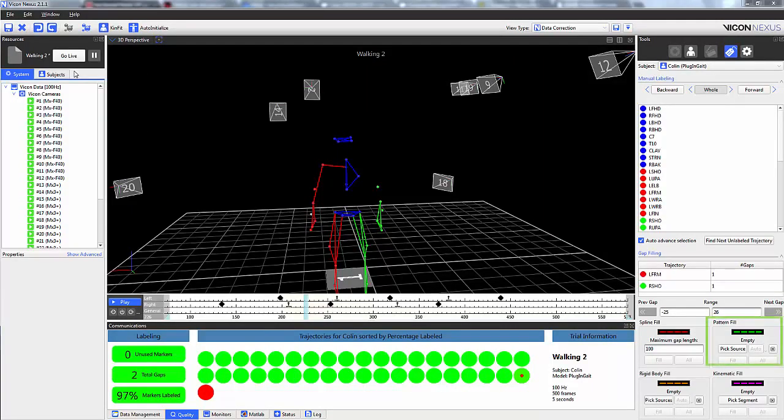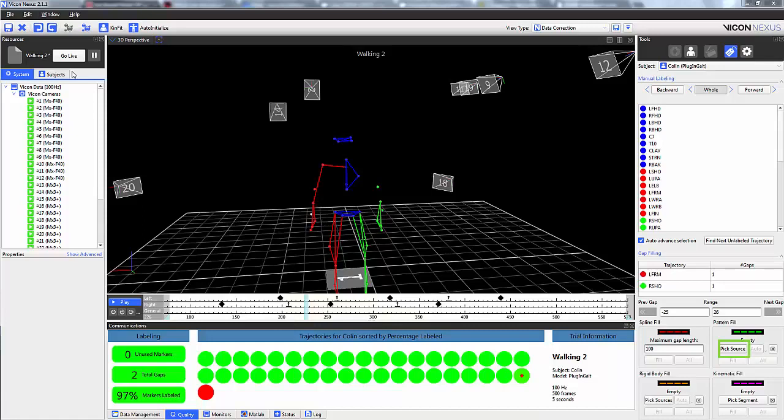We can also use the pattern fill, which is the green line. The pattern fill uses the trajectory of one marker to fill the gap of the missing marker. You can pick the source marker yourself, which is a marker that represents the movement of the missing marker, preferably one from a rigid body segment cluster. Or you can use the auto button, which mathematically selects the trajectory with the closest pattern. The X is there to clear the source.